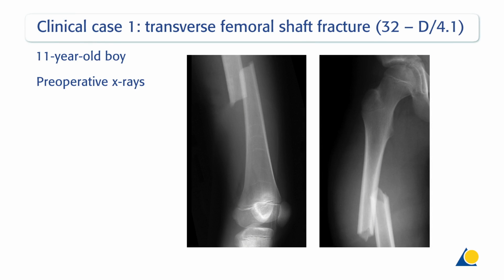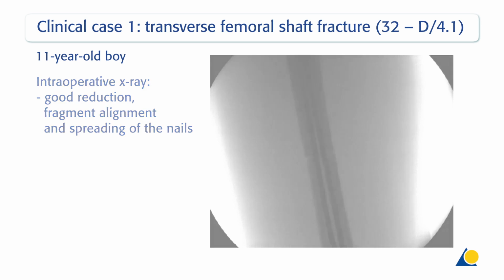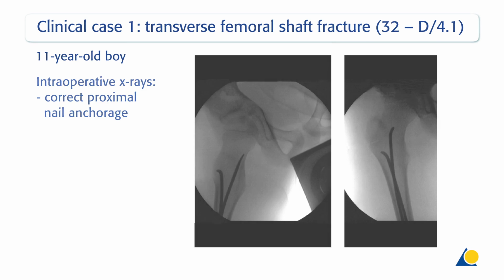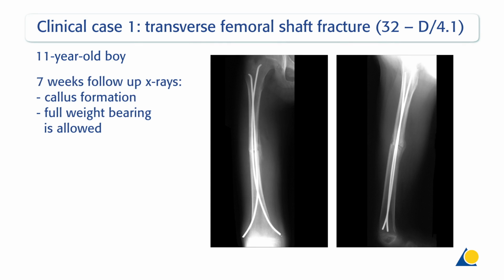The clinical case shows an 11-year-old patient with a transverse femoral shaft fracture 32-D/4-1. The intraoperative X-ray shows good reduction, fragment alignment, and perfect spreading of the nails at the fracture site. The correct proximal nail anchorage is achieved. The post-operative X-rays demonstrate correct alignment. The 7-week post-operative X-rays show callus formation and full weight bearing is allowed.